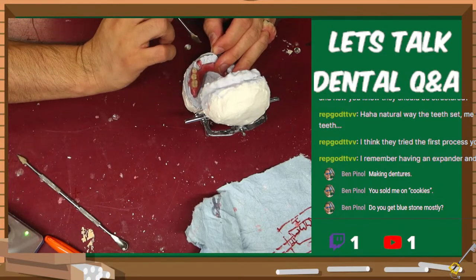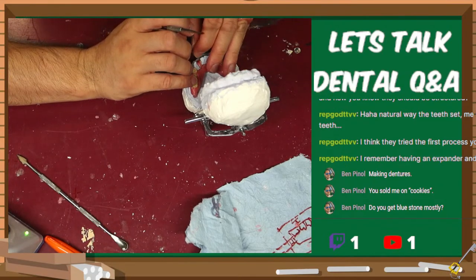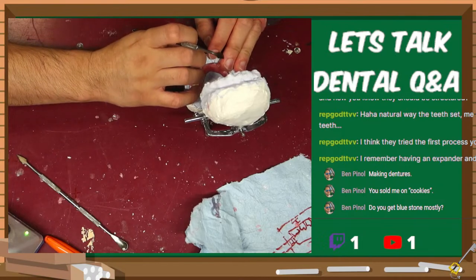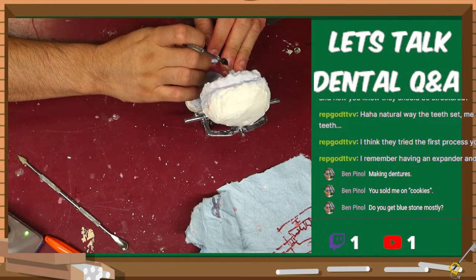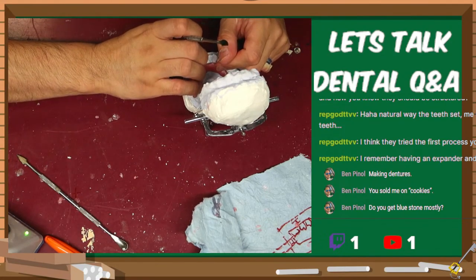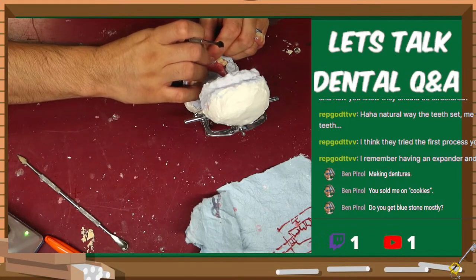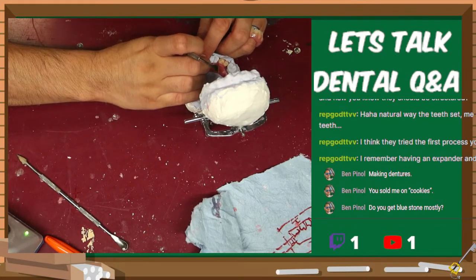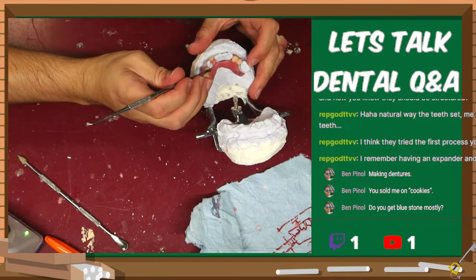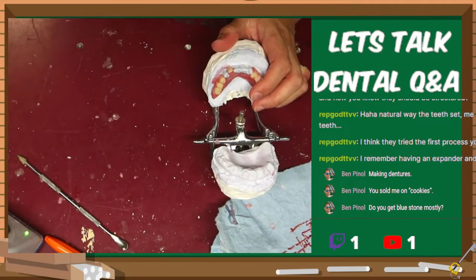I remember having that expander and having to crank that thing every other night. Yep, that palatal expander has a key, and you put that key in the hole, like you probably remember, and had to give that a nice little one turn, two turn, or whatever they wanted you to do, until they said, oh, you're all done with it. All right, that went in fairly smooth as it comes to it. Let's go in.